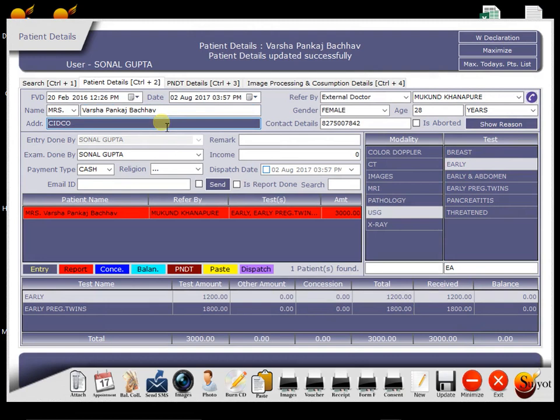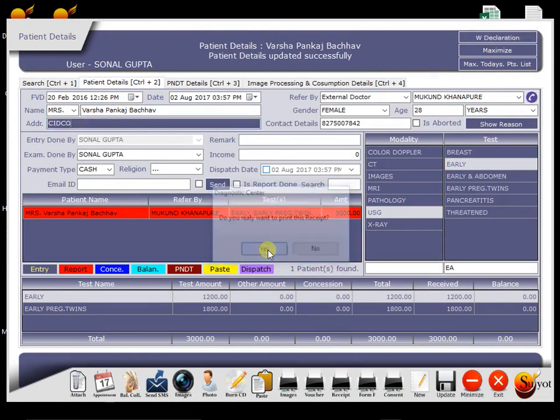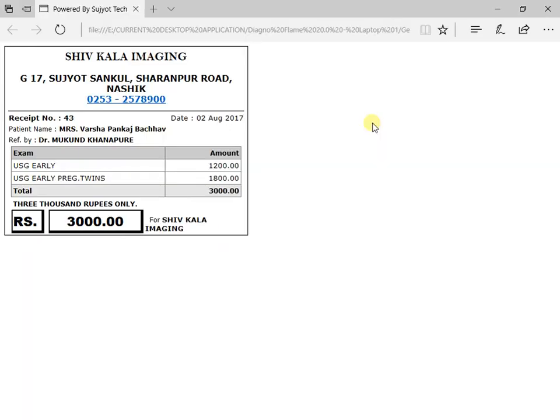Now if patient wants receipt, then we can give her by clicking this button. So this is the receipt.